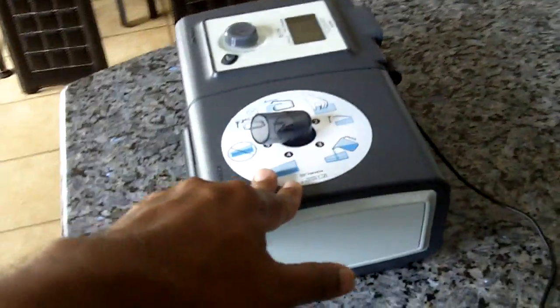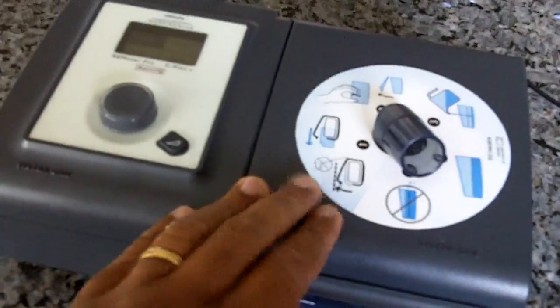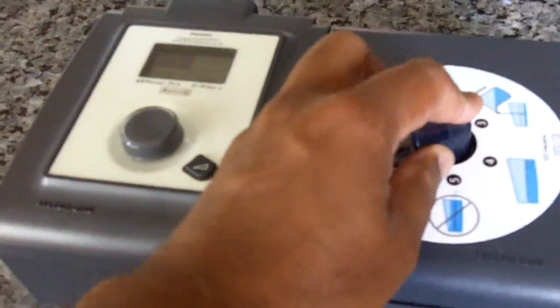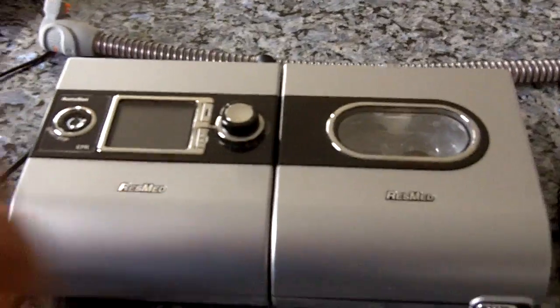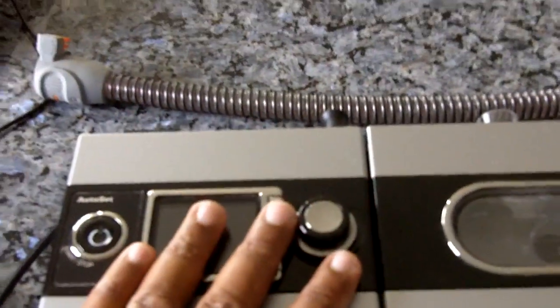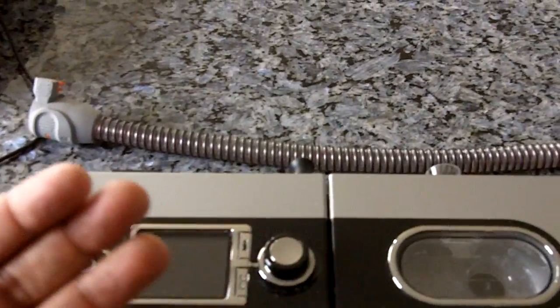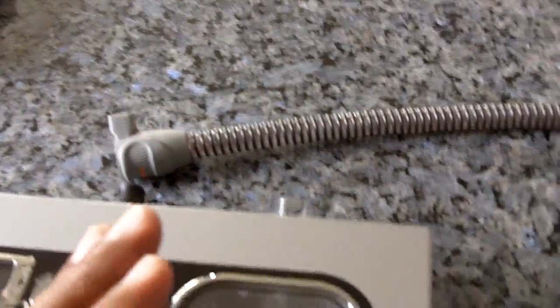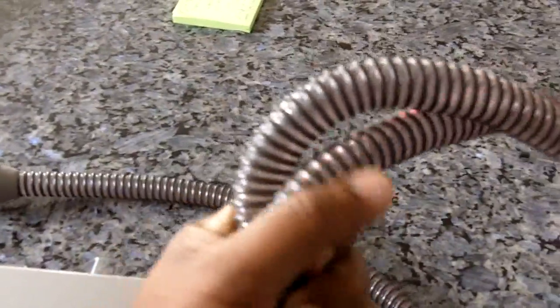Well, Respironics about a month ago, back in the month of May or April, around that time frame, came up with this heated tubing. Okay, this particular model I cannot attach it. So basically there are heated wires embedded in this tubing, and this will maintain the temperature. It makes the experience a lot richer. You will get so much more moisture, and for some reason, I'm telling you, you'll feel that the CPAP pressure, the air, feels lighter. Also, it reduces condensation, water in the tubing.